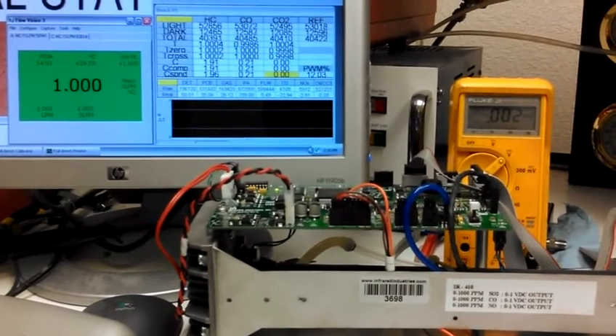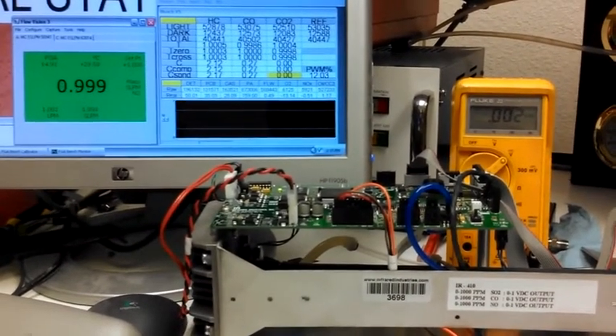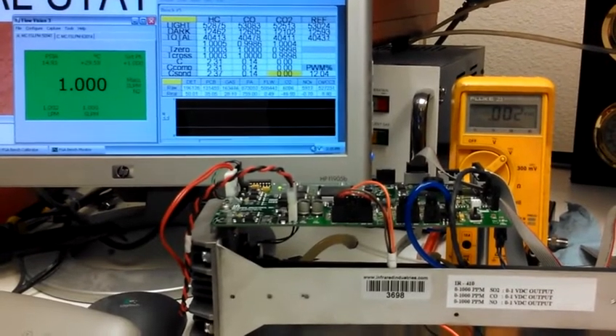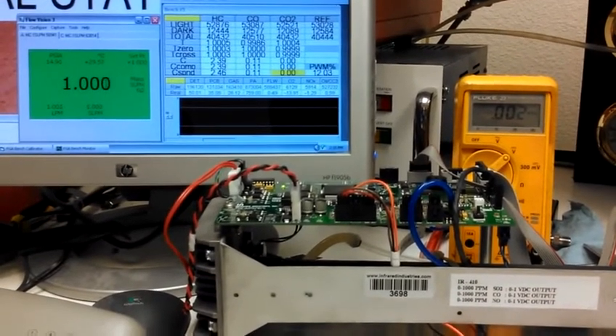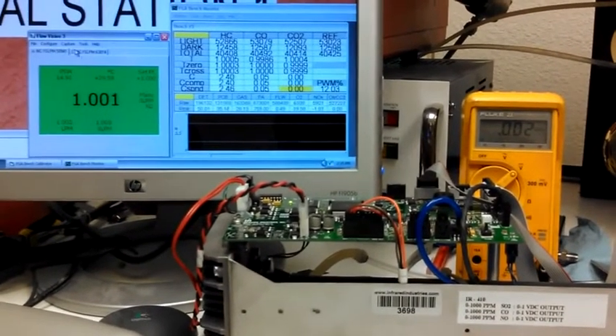This is the second bench from Ace, returned serial number 3698, complaining of no NO response. We're going to go ahead and enter the NO gas.